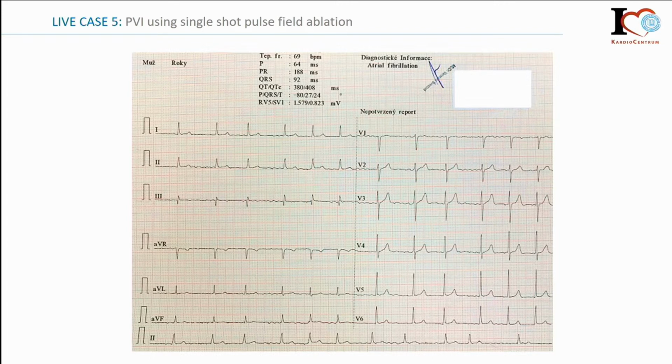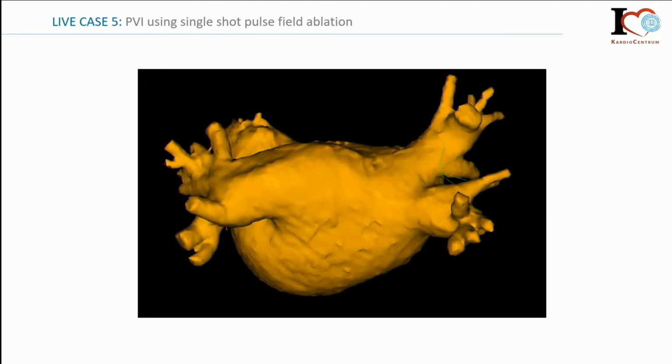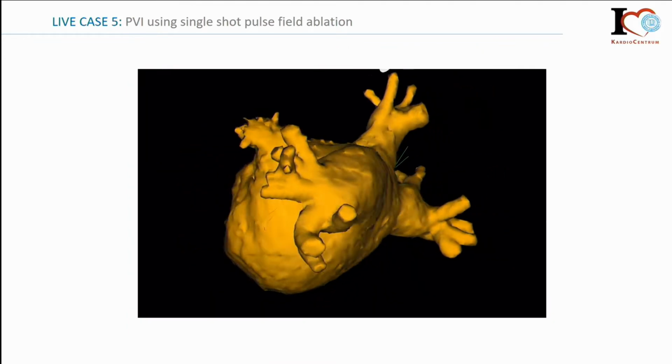Here you can see the 12-lead EKG from yesterday, where we see atrial fibrillation, and the 3D model of the left atrium, showing the left common.